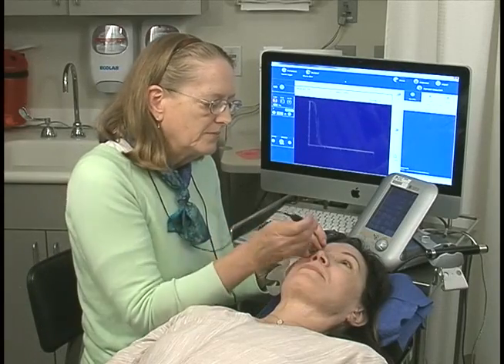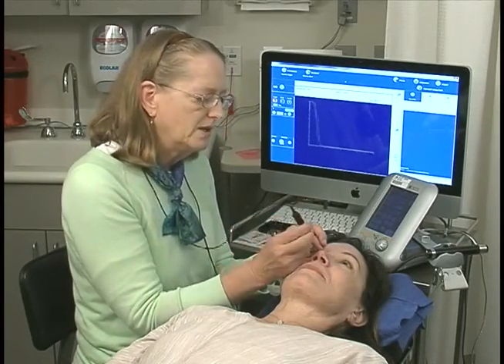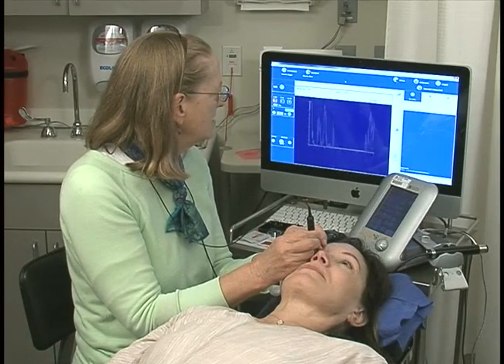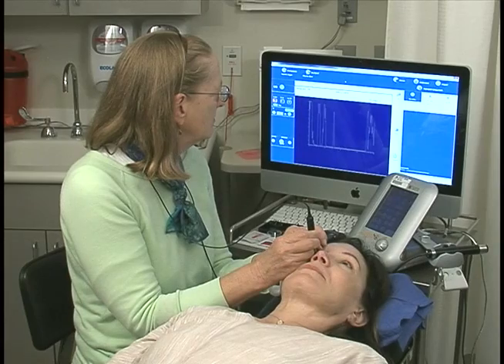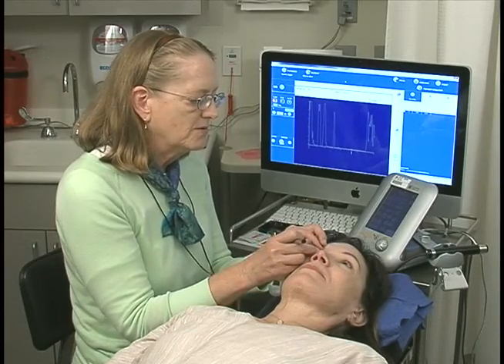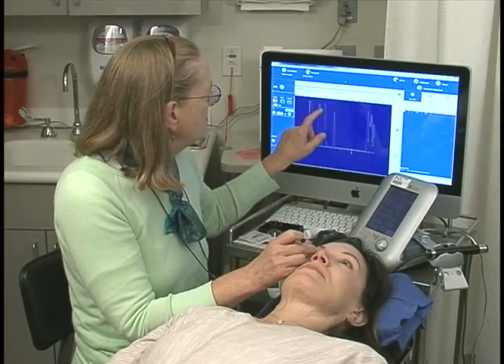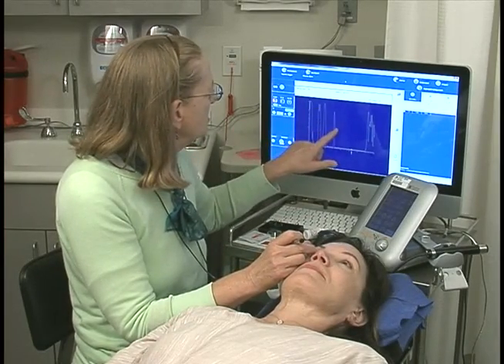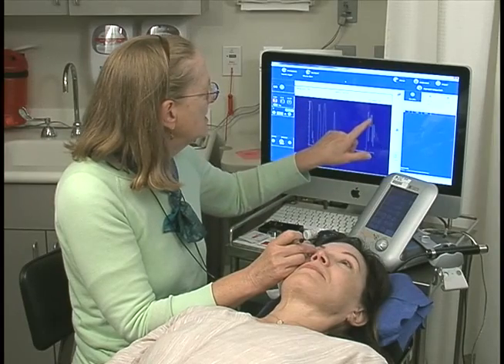I now finish filling this with saline, and then I place the tip of my probe into the fluid, holding it close. And there I am getting an axial length scan. What I'm seeing on the screen is anterior-posterior cornea of equal height and anterior-posterior lens, retina, and sclera.